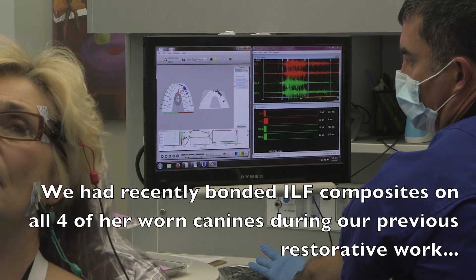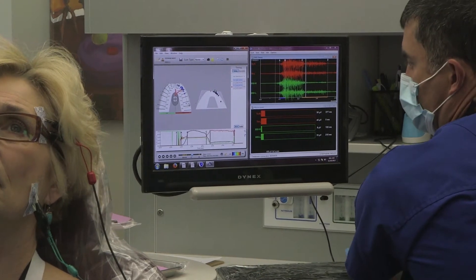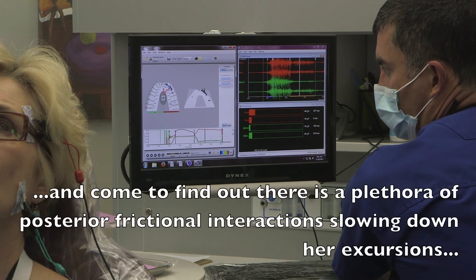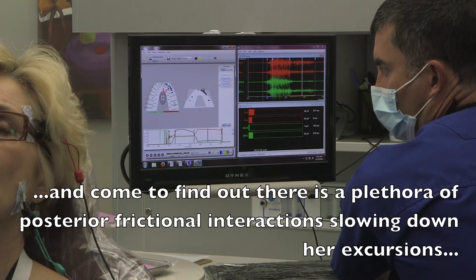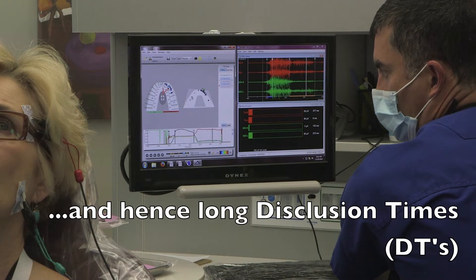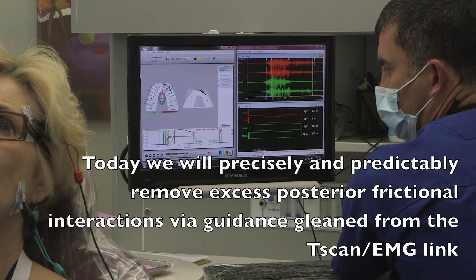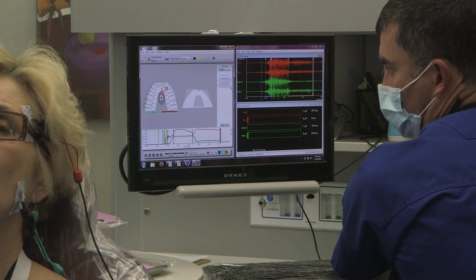Partly because we bonded that spot. But look back here — see this interference there? And there? And over here? That doesn't belong. See, it's chronically there. It's slowing you down. So because these back teeth rub continually, that causes the brain to want to make those little rubs go away. So you do clench and grind to try to eliminate them. Look at all these things — over here, you're about to separate the back teeth. Finally. That's the point. And it took you 1.37 seconds to do so.